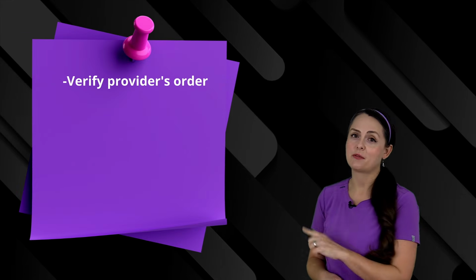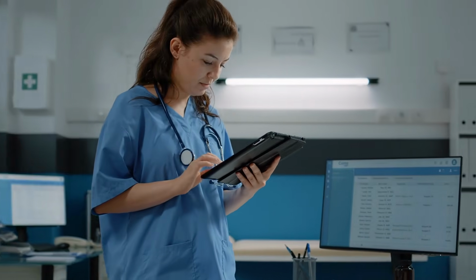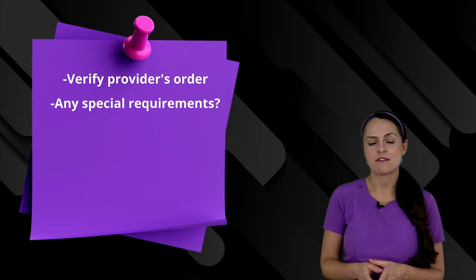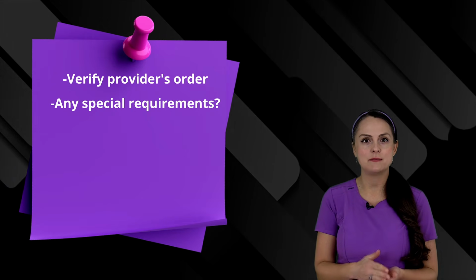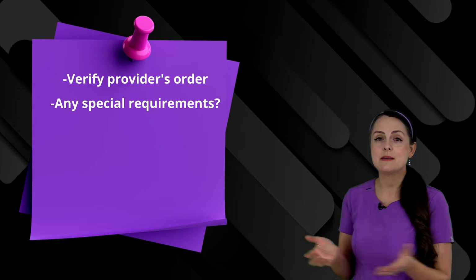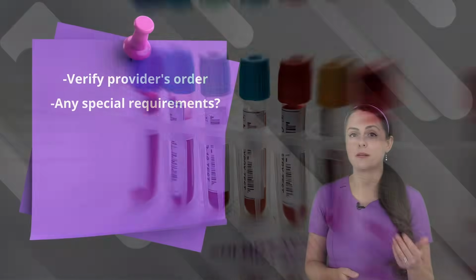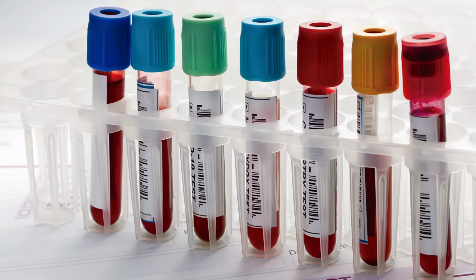verify the provider's order. So take a good look at that order and check out what has been ordered. Then you want to ask yourself, are there any specific requirements that need to be done before you actually draw the blood? For example, maybe the patient needs to be NPO, nothing by mouth, before you actually draw the blood. This is the case with metabolic panels, iron studies, just to name a few.